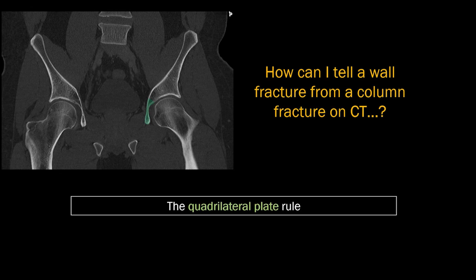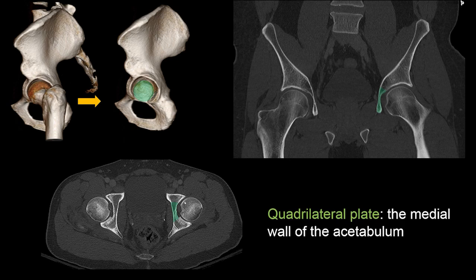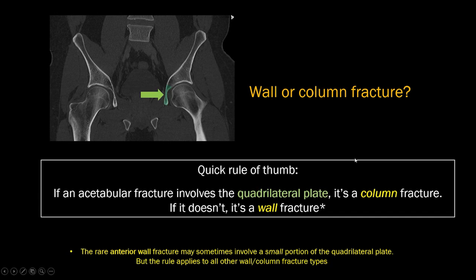On your CT images, how are you going to tell the difference between a wall and a column fracture? The CTs don't come color-coded. We're going to use the quadrilateral plate rule. The quadrilateral plate is the medial wall of the acetabulum — visible on routine axial images and on coronal images. The quick rule of thumb is: if the acetabular fracture extends through the quadrilateral plate, call it a column fracture. If it doesn't, it's just a wall fracture.